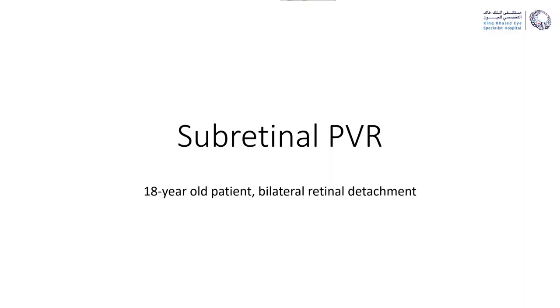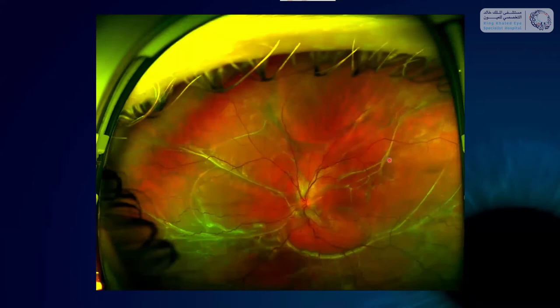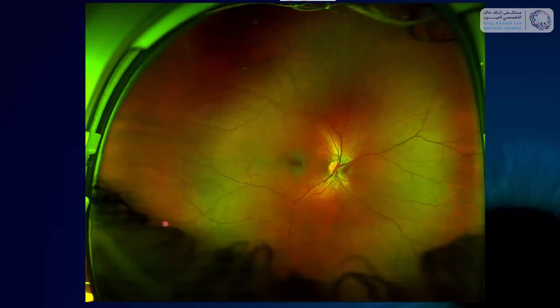This is a case of subretinal PVR — again a young patient, 18 years old — who came in because he started seeing a peripheral scotoma in his second eye. He had lost visual acuity in one eye six months ago and hadn't told his family, so he came in with a long-standing detachment. In the photograph you can see subretinal scars with the retinal vessels lying on top. In his other eye he had a detachment in the lower temporal quadrant.